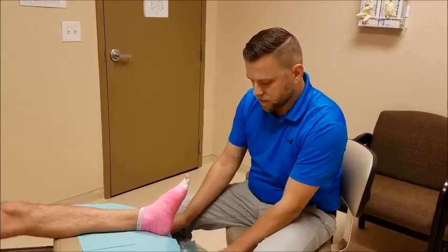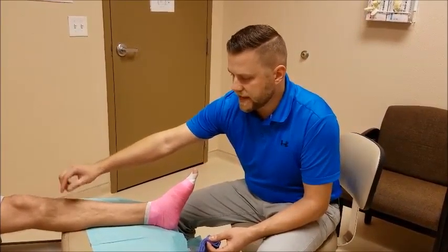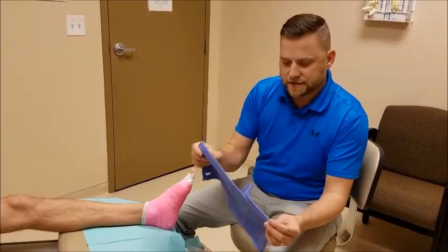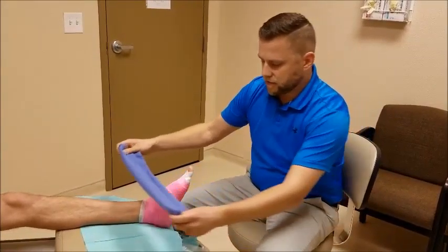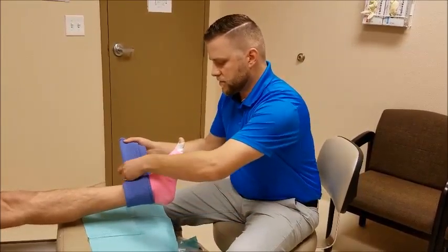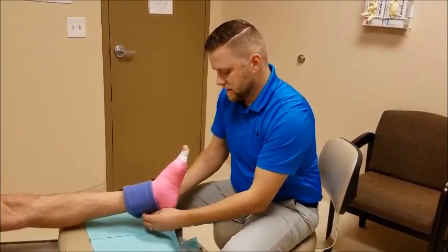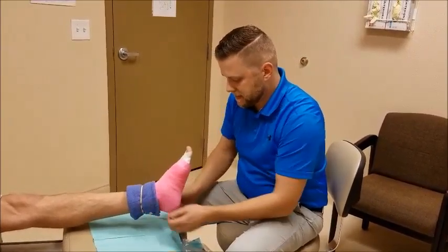When you put this on, we always ask you to put a small towel around the ankle — or around the knee if it's a higher cast — in case any water drips down. You can just wrap it around the leg like this. If it wants to fall down, you can fix it with a rubber band or a piece of tape around it.